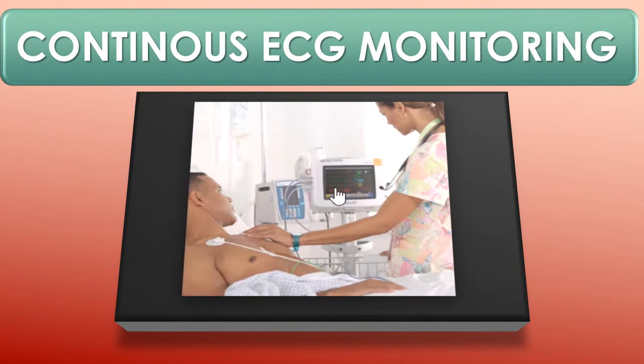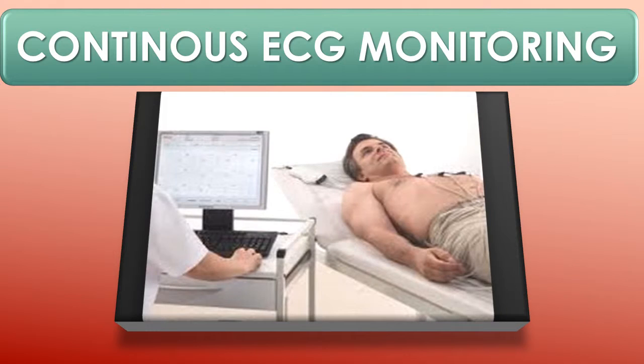On a unit with full disclosure monitors that monitor patients for continuous ECGs, you want to place the electrodes not on the limbs, to avoid artifact. You want to place them on the trunk of the patient. ECG cables may be hardwired or they may be battery operated.